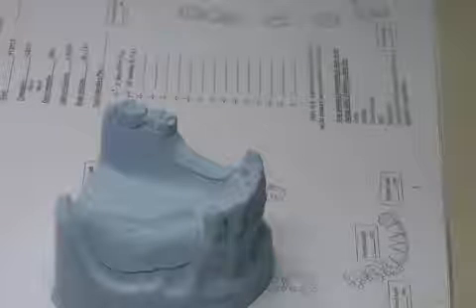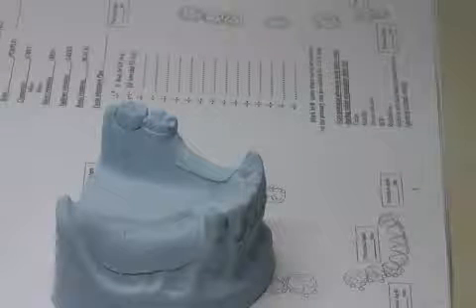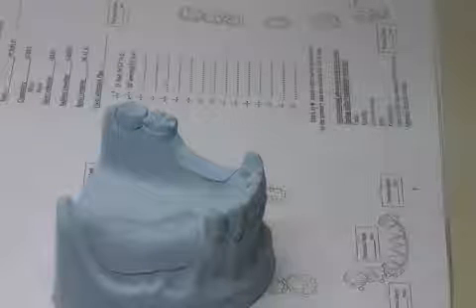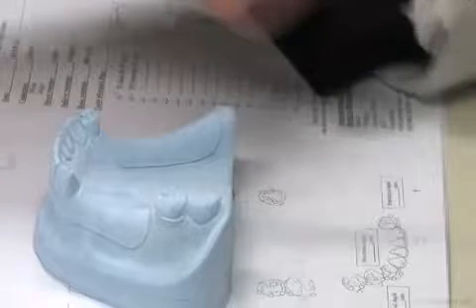So, what do we call the support for a bounded area? Tooth support or tooth-borne support, or dental support in some references. But when we have a free end saddle, what do we have? Tooth-tissue support. Now, in the cases we have designed, we have not followed even the simplest design. I'm going to talk first about the simplest design, and then how we change it.